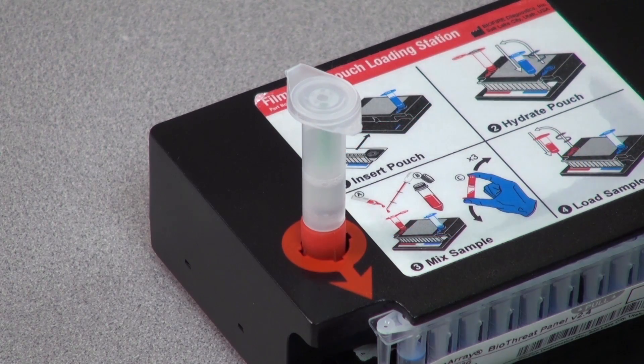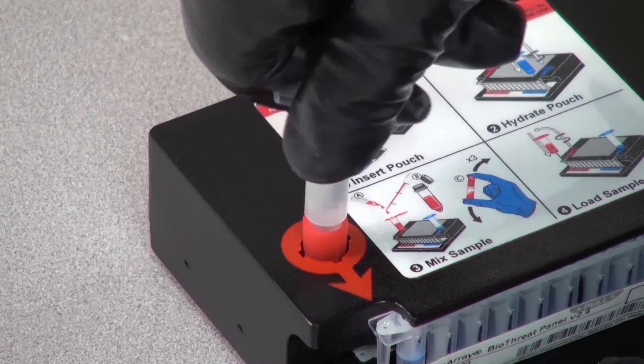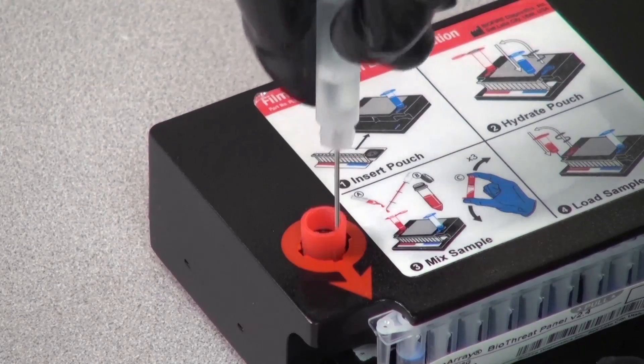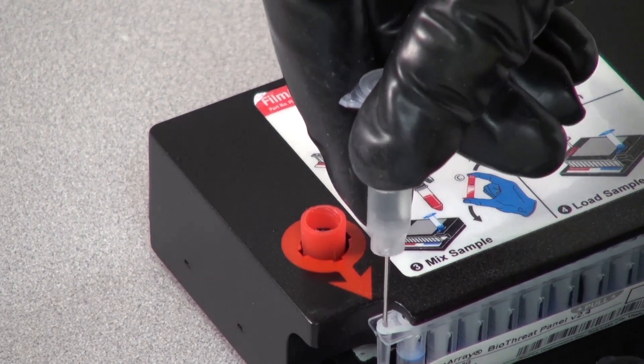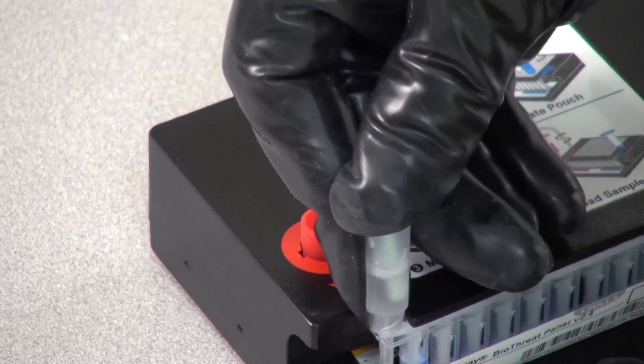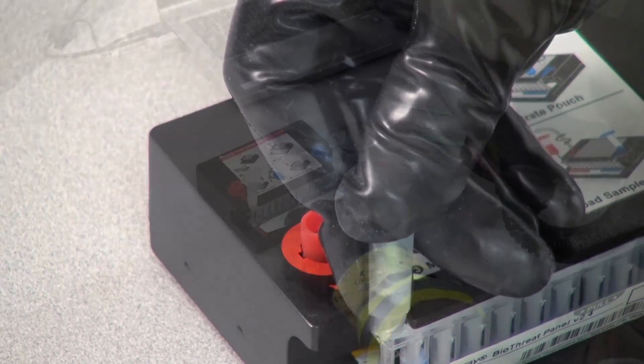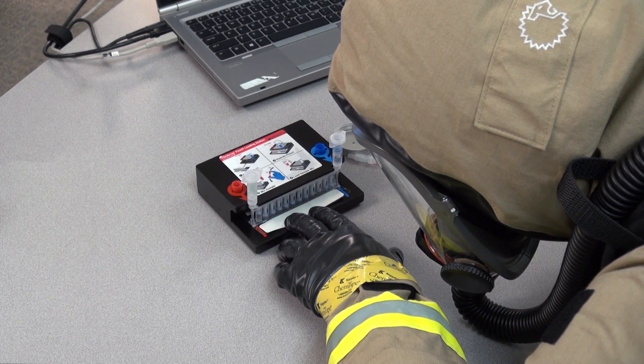Next, unscrew the injection cap from the red vial, leaving the cap in the loading station. Insert the red vial into the sample port of the pouch like before. Wait 5 seconds, then inspect. The pouch is now prepared.